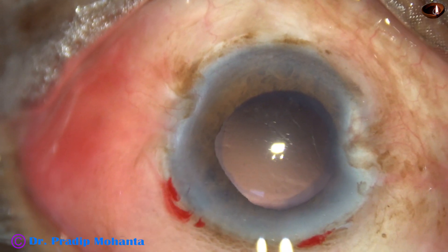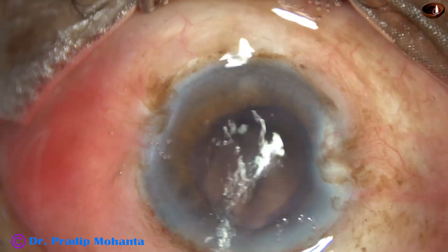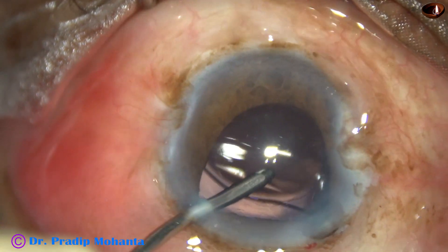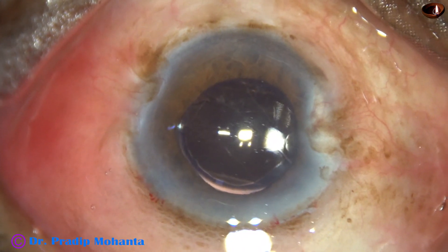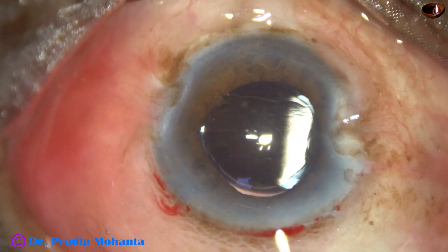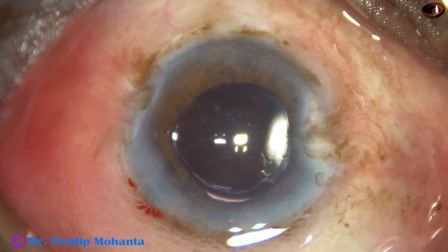And now we can implant the intraocular lens with Visco or with the help of irrigation. As I place the irrigation, the iris tends to prolapse through the ports, which means there is some element of floppiness of the iris. The iris could be reposited easily. This is a bit of moxifloxacin. The side port is hydrated, the anterior chamber is nicely formed, and the case is concluded.